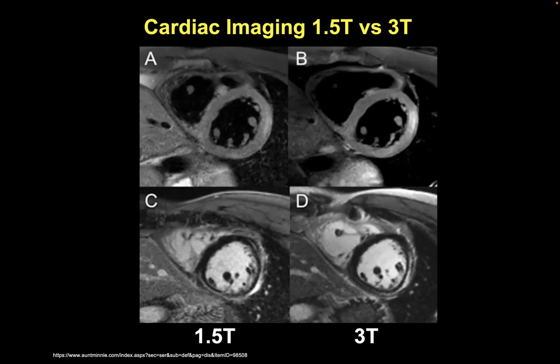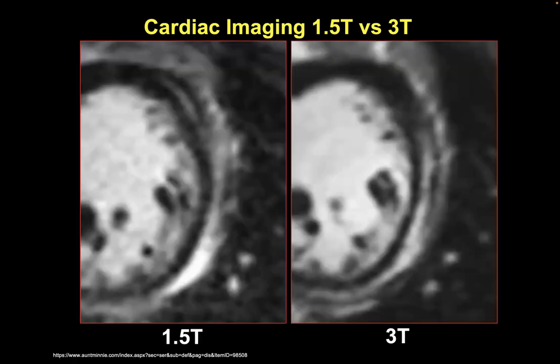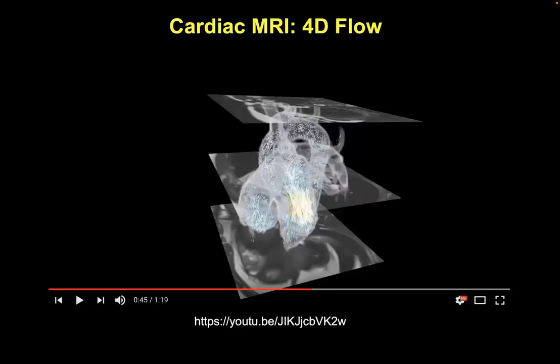It was predicted, there are great papers too, by really smart people, predicting that over 40 megahertz you would not be able to do MRI because the RF would get absorbed too quickly. So none of the RF would get into the patient. And it was theoretically shown that you couldn't do it over 40 megahertz. This is 64, this is 128, and they look just fine. So that's always like, should you believe theory? Well, look at the measurement. So you can see a difference in the signals.